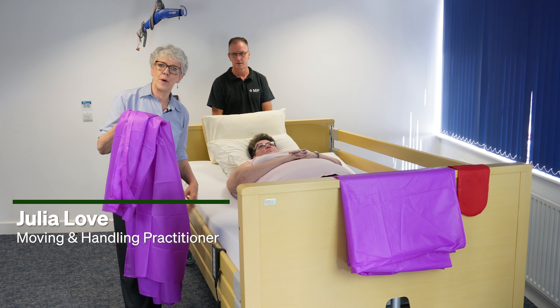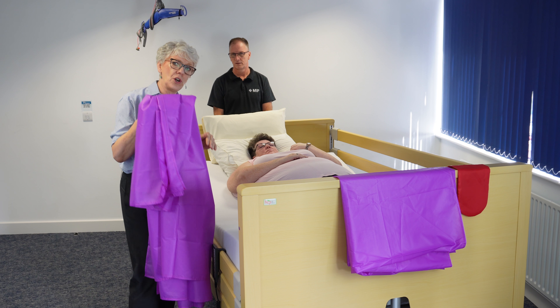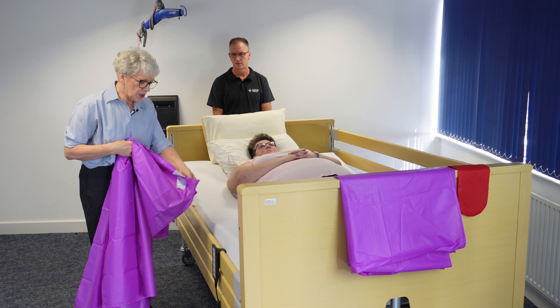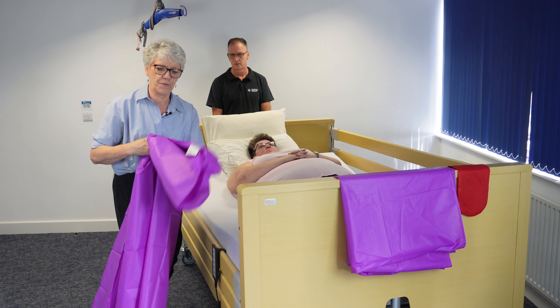Hello, my name is Julia Love. I'm a moving and handling advisor, and I'm here with Lou and Chris. We're going to demonstrate how to position two flat slide sheets underneath Lou, ready for either moving up the bed or for rolling. I'm using two flat slide sheets without handles — you can also get slide sheets with handles, which some people find useful.